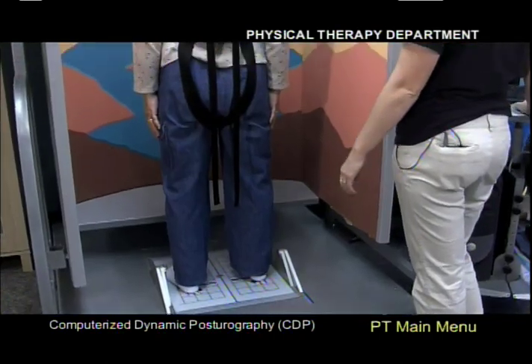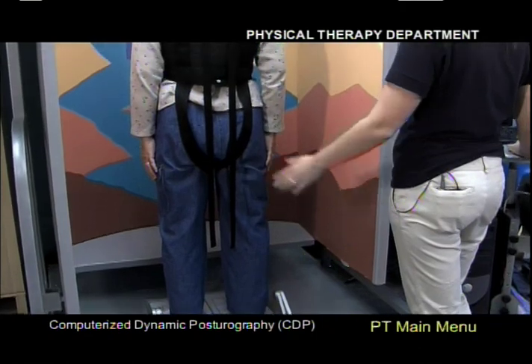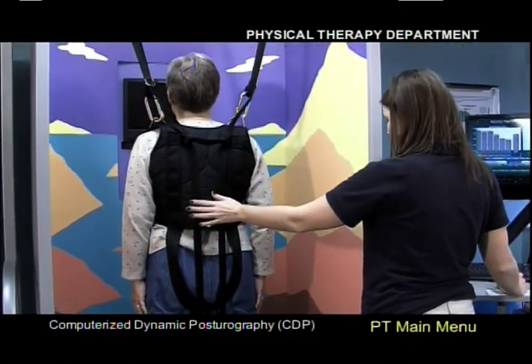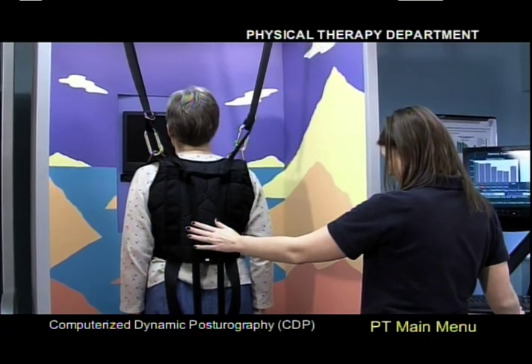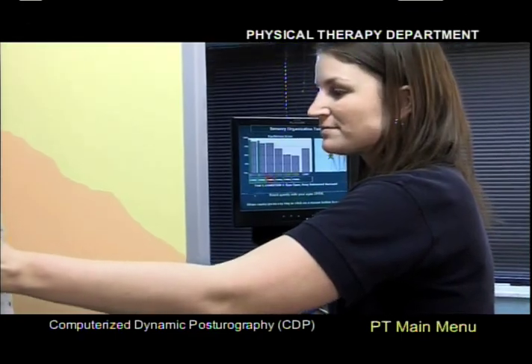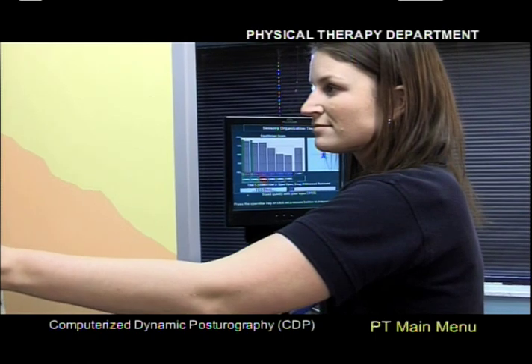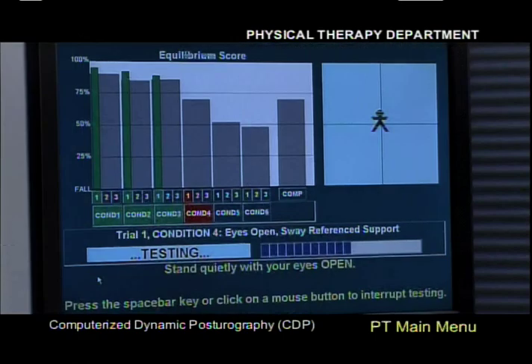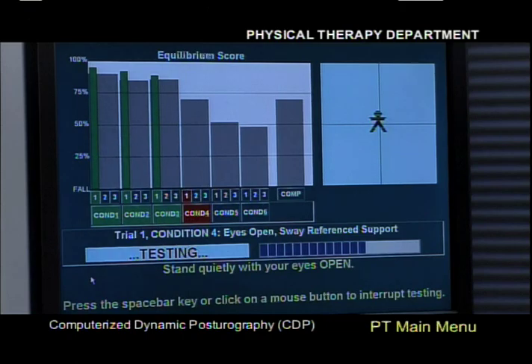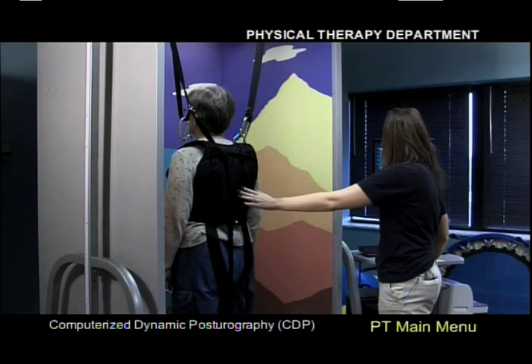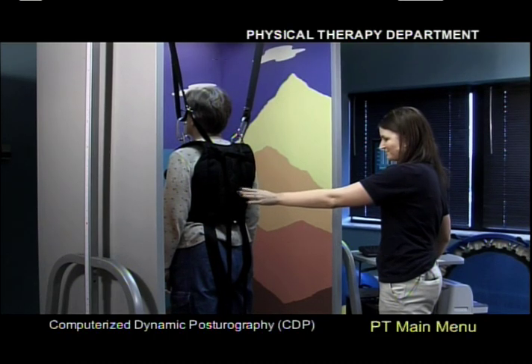The motor control test quantifies the patient's ability to quickly recover following an unexpected external disturbance. Sequences of small, medium, or large platform movements in forward and backward directions measure reaction time. Automatic postural responses are the first line of defense against a fall from unexpected external disturbances and correlate highly with slipping and tripping.